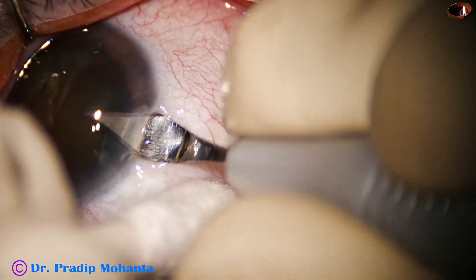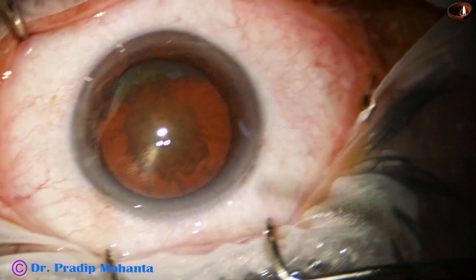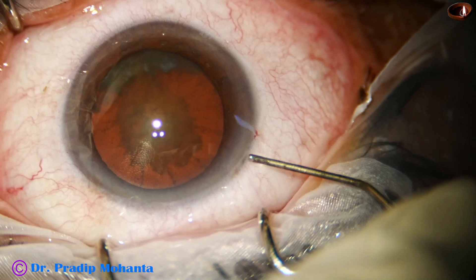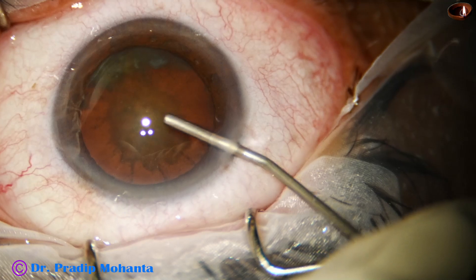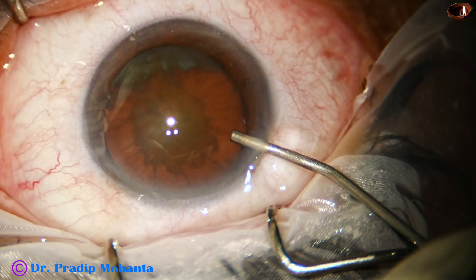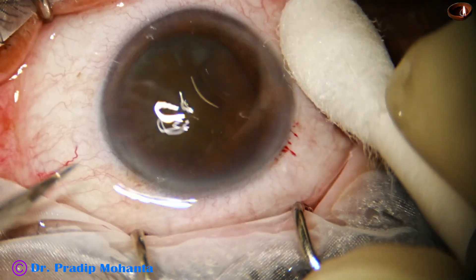This is the main incision with a 2.8 mm steel keratome. This is a bit of proparacaine — the patient is under topical anesthesia. The anterior chamber is filled up with viscoelastic, 2% HPMC.